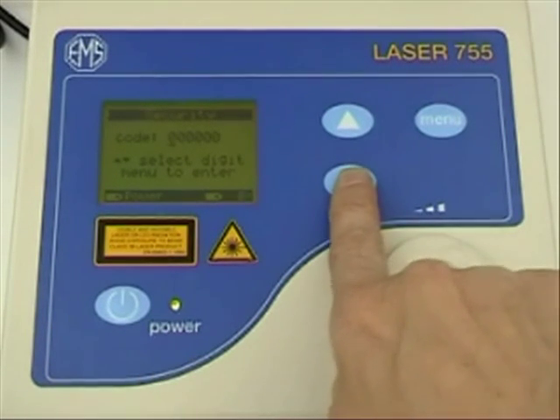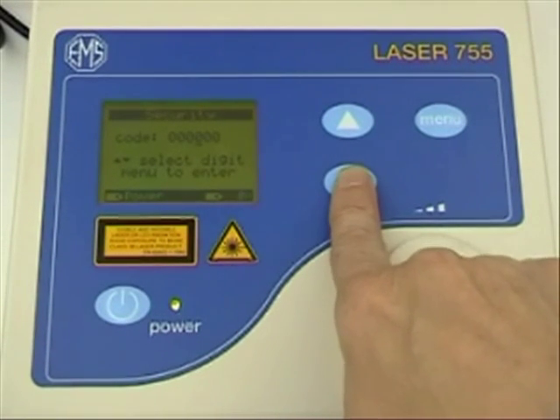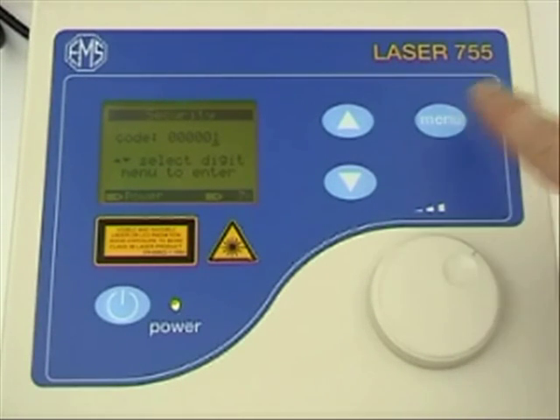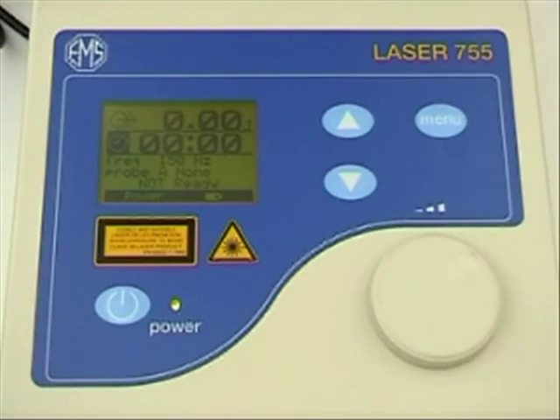The Solo Laser 755 from EMS Visio has a PIN number keyless security system. This enables only authorised users to operate the laser.